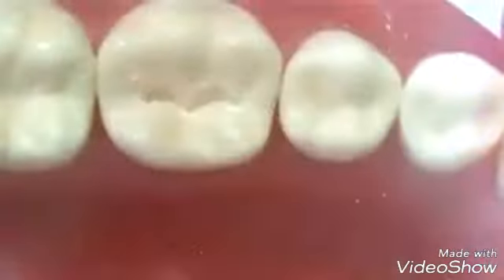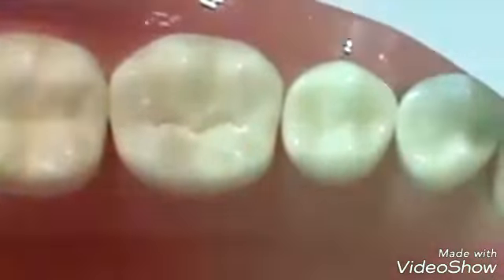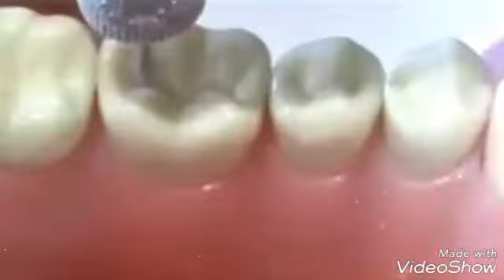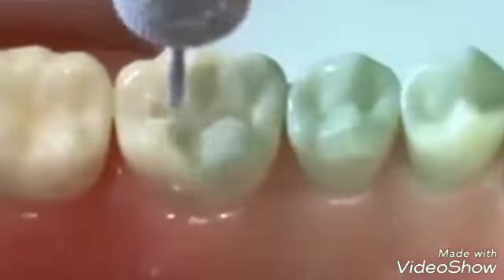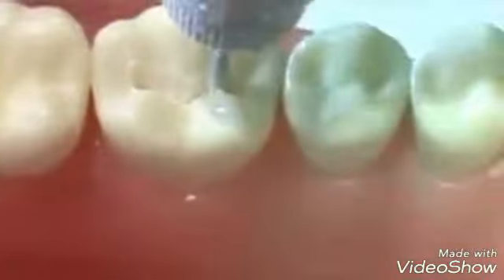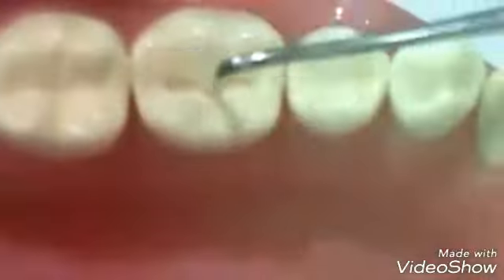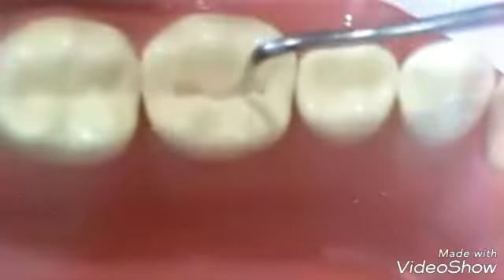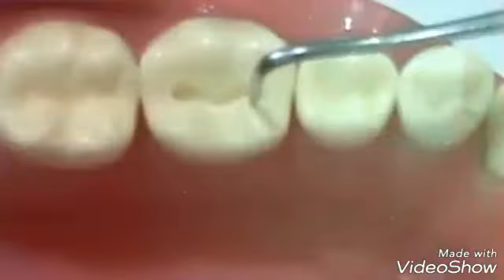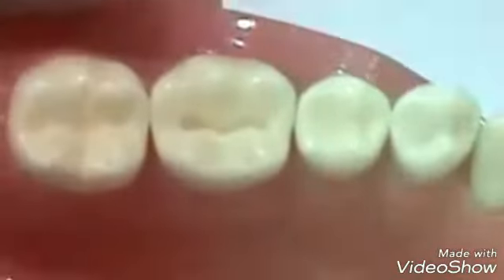This is the initial outline of the cavity. As you could see here, we have to make the shape of the cavity rounded without any sharp corners.